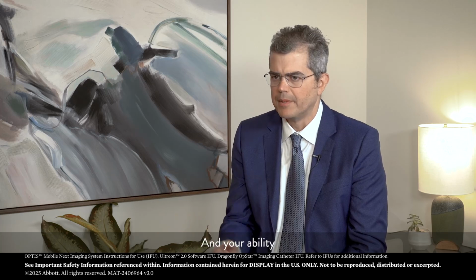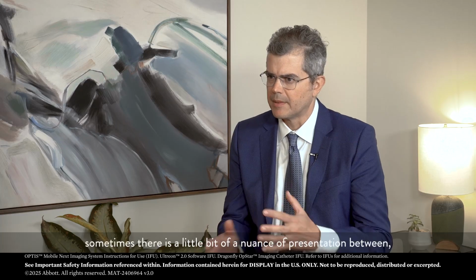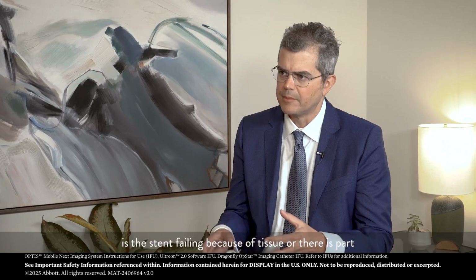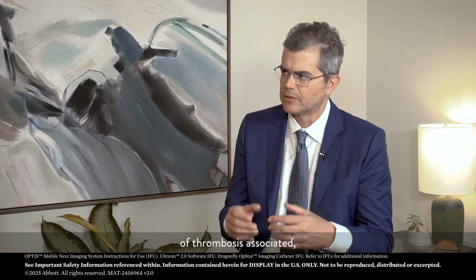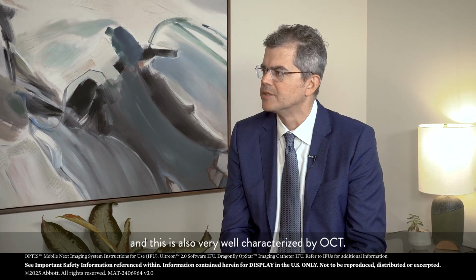And your ability to detect lipid is better. If you think about ISR, sometimes there is a nuance of presentation between whether the stent is failing because of tissue, or whether there is thrombus associated, and this is also very well characterized by OCT.